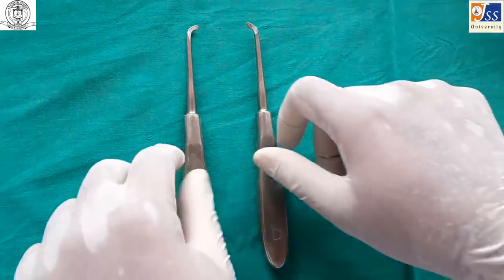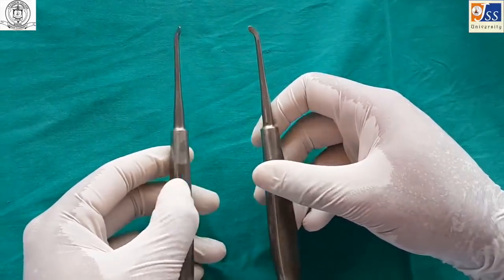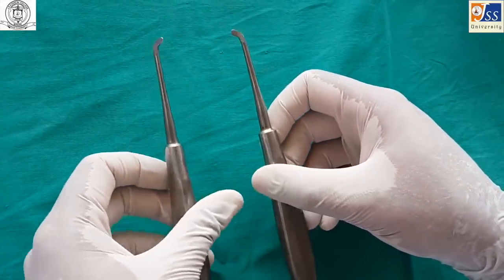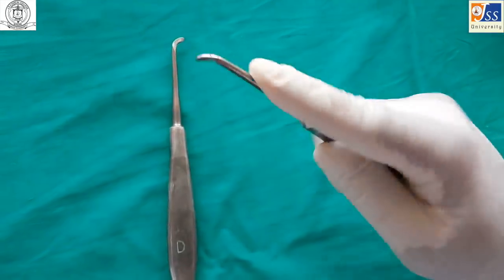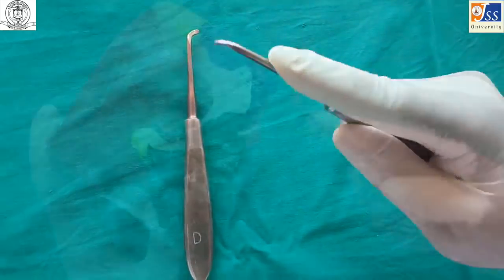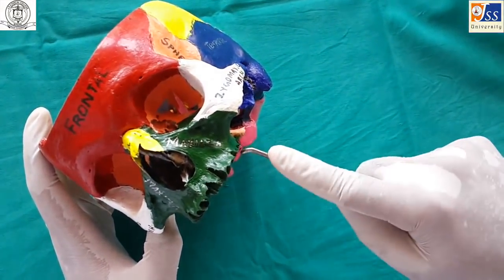The Warwick James elevator is a paired instrument available for the right and left side, and comes in curved and straight varieties. It is usually used for third molar extraction.